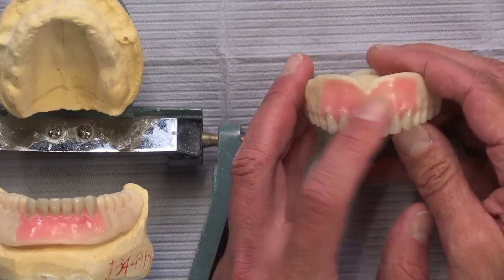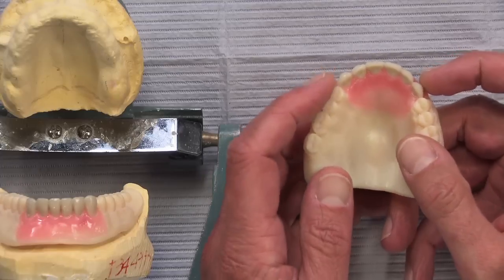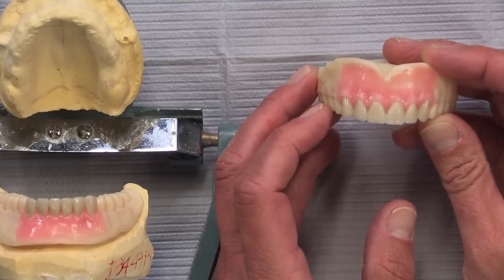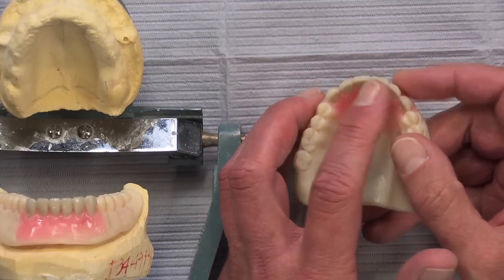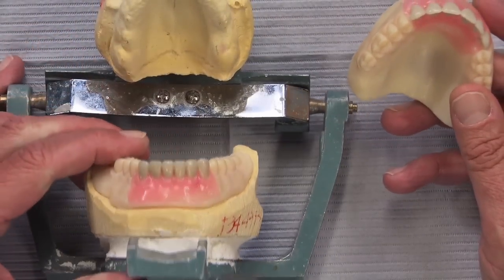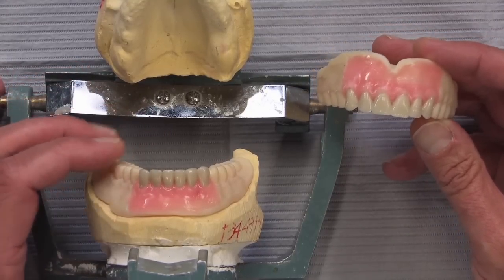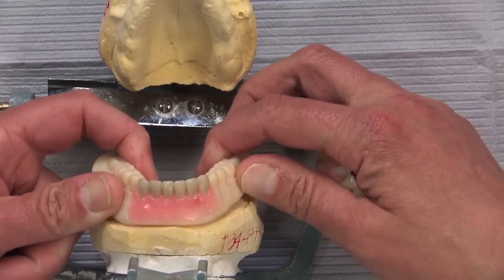We're able to set the anterior teeth into some pink wax so you can make adjustments if necessary. All the anterior teeth are available to be moved — they're in a perfect arch right now, but if something needs to be longer, rotated, or whatever, it's simply a matter of heating up a wax spatula, softening the wax, and moving the teeth where you want them. The same applies to the lower anteriors — we now provide all six anterior teeth in case you need to adjust overjet or overbite.